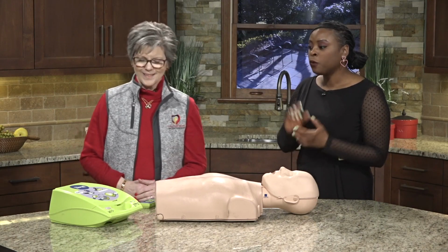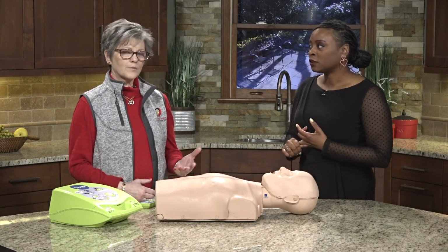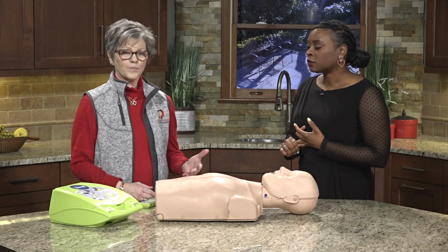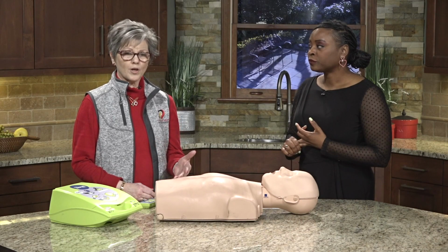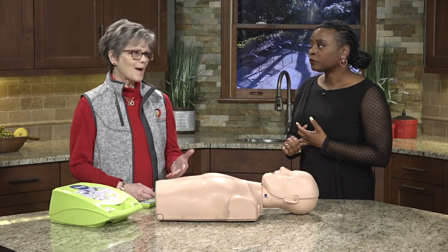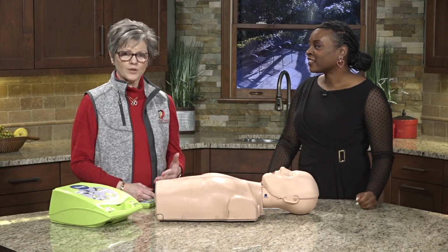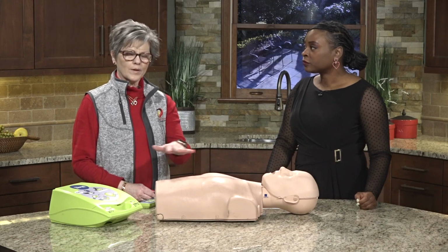Awesome. Ready? So when should you use one and when should you not use one? Well, if your victim is unresponsive and an AED shows up to your emergency, you should go ahead and put it on then. Your AED will analyze and tell you when to shock. If Fred happens to have a rhythm of some sort, it will not shock. So it's looking for that rhythm as it's going through and analyzing.